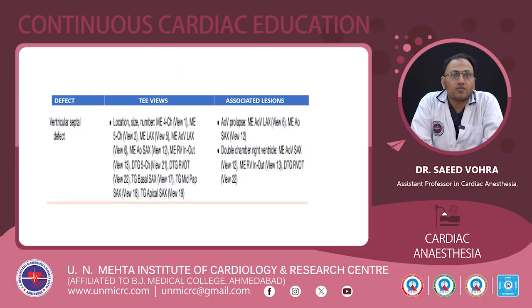Now, coming to the VSD patients, the location, size and number of the VSDs are to be noted. The views used are mid-esophageal four-chamber view, mid-esophageal five-chamber view, mid-esophageal long axis view, mid-esophageal aortic valve long axis view, mid-esophageal aortic short axis view, RV inflow-outflow view, and deep transgastric five-chamber view. There can be prolapse of the aortic valve, which is best seen in the mid-esophageal aortic valve long axis view and mid-esophageal aortic short axis view. There can be double chamber right ventricle, which is seen in the mid-esophageal aortic valve short axis view, mid-esophageal RV inflow view and deep transgastric RVOT view.